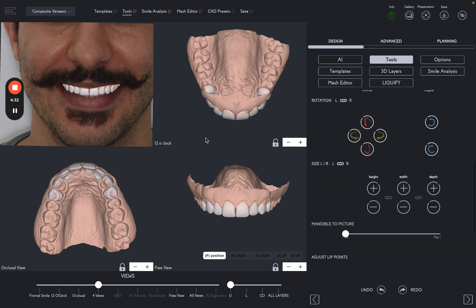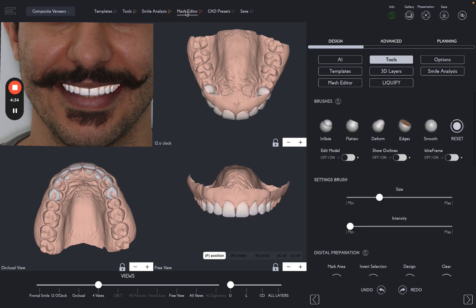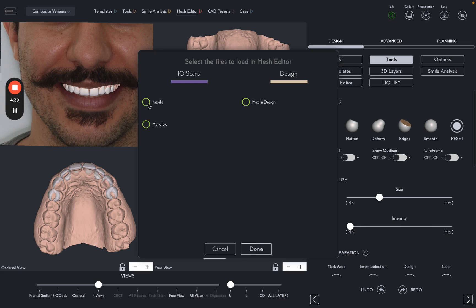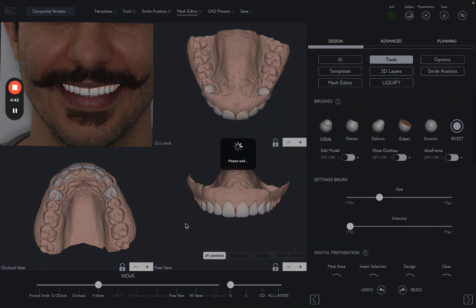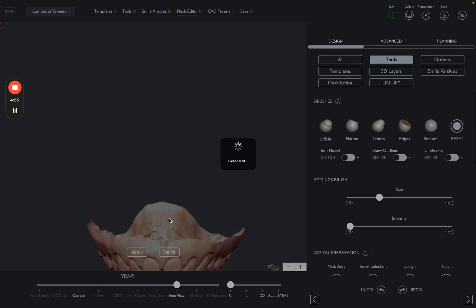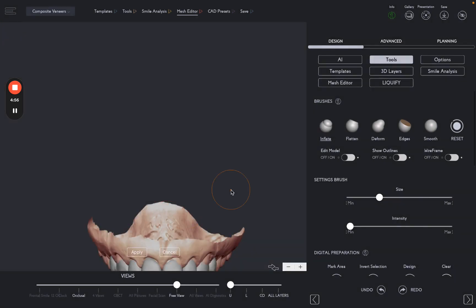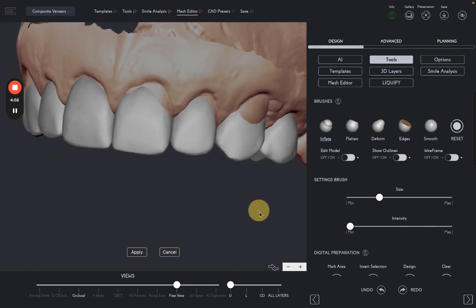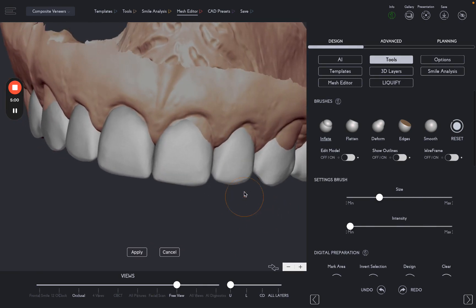To finish our design, we will go to Mesh Editor and fine-tune our templates. Let's start by adding material on the area where it's needed.